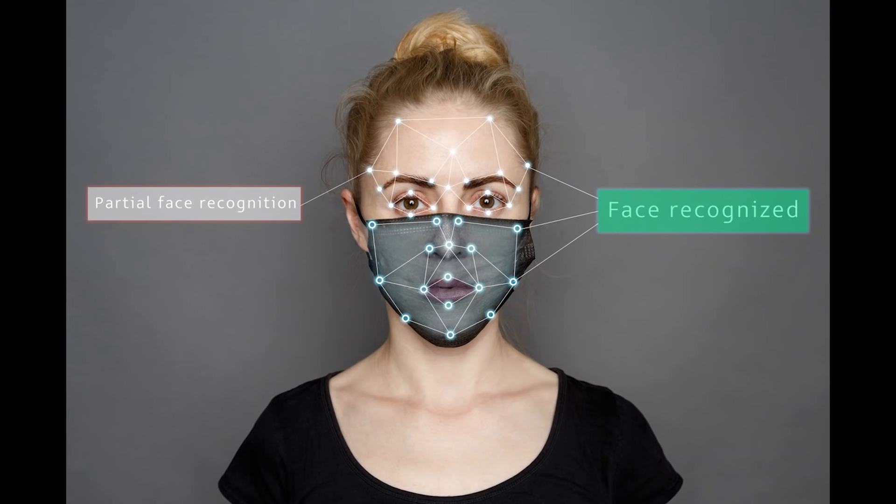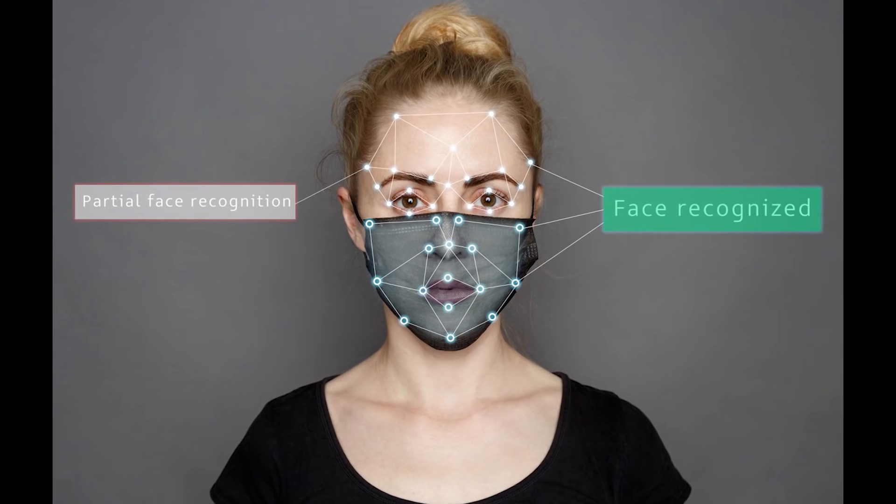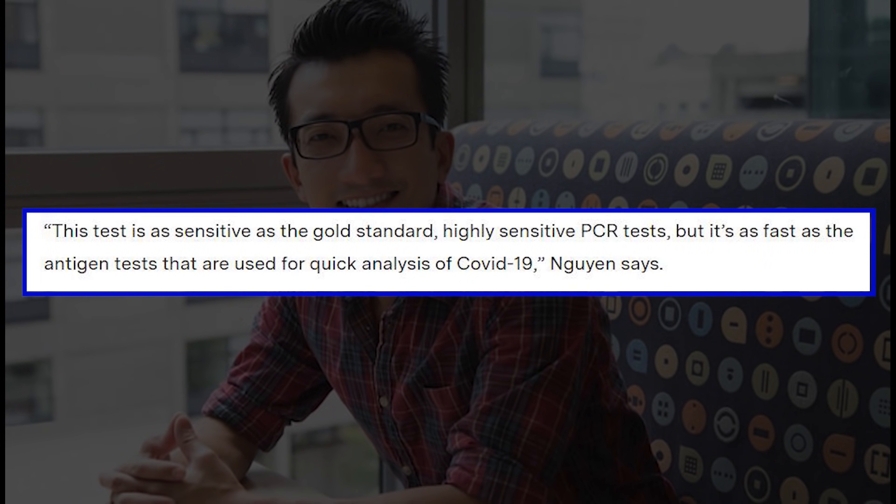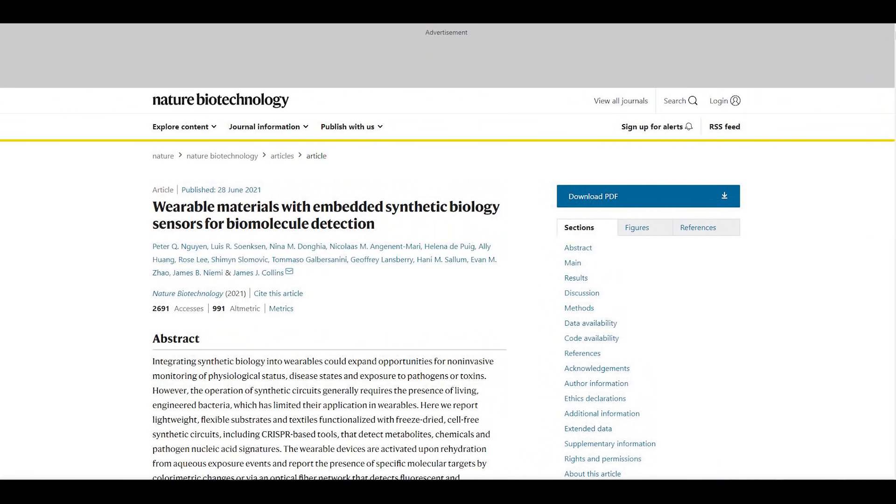The wearer just has to wait 90 minutes to get the results. This test is as sensitive as the gold standard highly sensitive PCR tests, but it's as fast as the antigen tests used for quick analysis of COVID-19, said Peter Nguyen, research scientist at the Wyss Institute for Biologically Inspired Engineering. Findings were published in Nature Biotechnology.